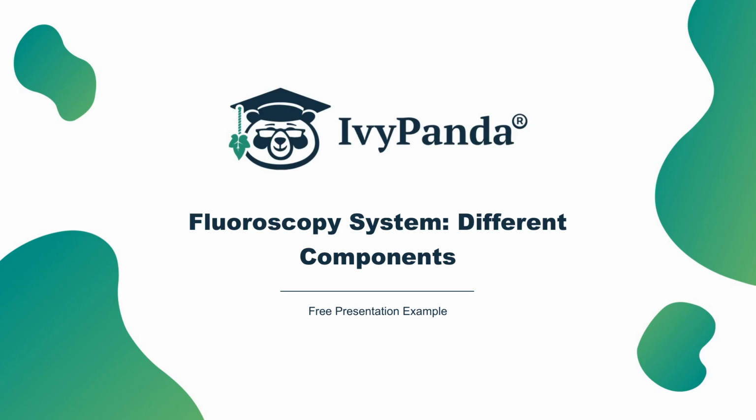Flat panel detector types. Flat panel detectors, or FPD, are used in digital fluoroscopy and radiography to convert X-rays to charge or light. There are two types of FPD, direct and indirect. Direct conversion FPD convert X-rays directly to charge, while indirect conversion FPD convert X-rays to light first and then to charge. The detectors of the direct conversion FPD are based on amorphous selenium, while the detectors of the indirect conversion FPD are based on amorphous silicon photodiode.